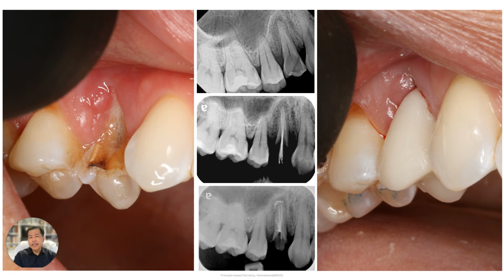And then some of the other things that I've shared with you is that today, with the endodontic techniques that we have, the instrumentation, the irrigation, the activation, everything that we have, our endodontic procedures are so much more predictable. So I often do this. These are two cases that I did this week. I often do my endo and my restorative all in one visit.